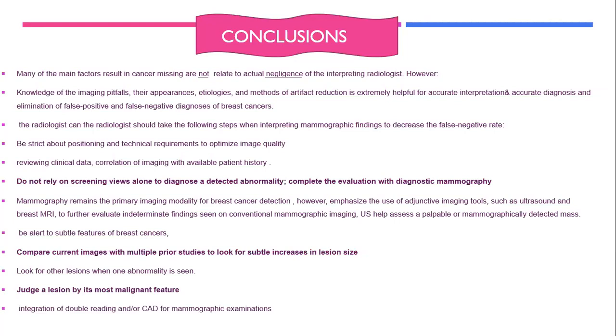Integrating double reading and or CAD for mammographic examination is helpful.